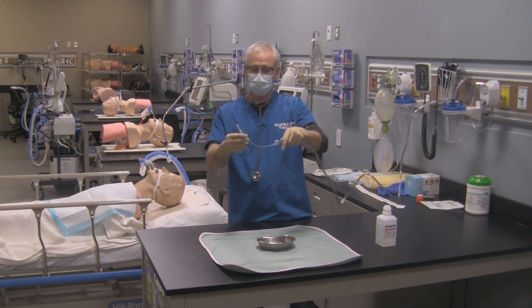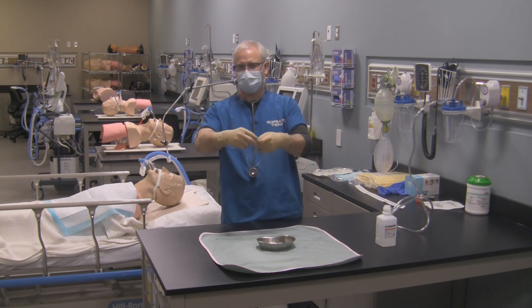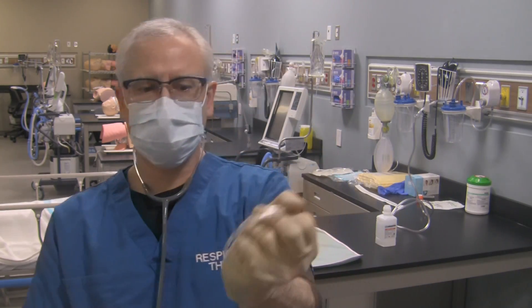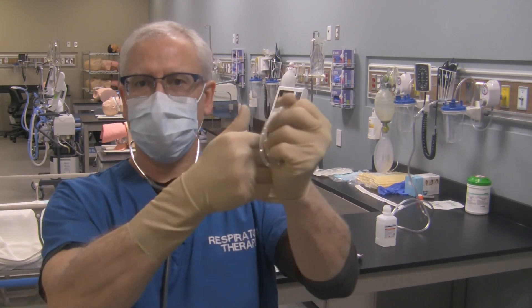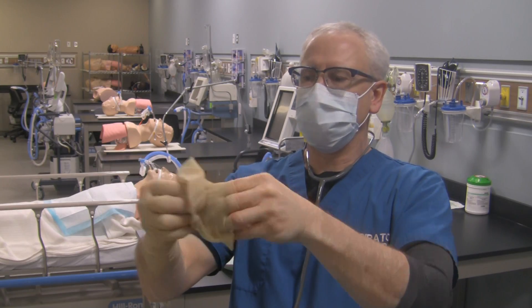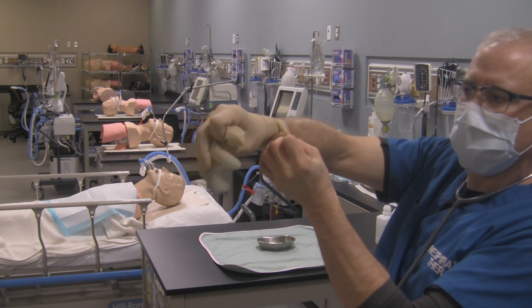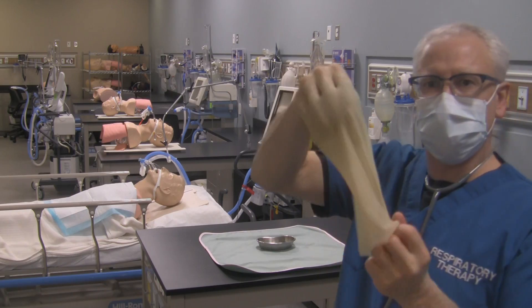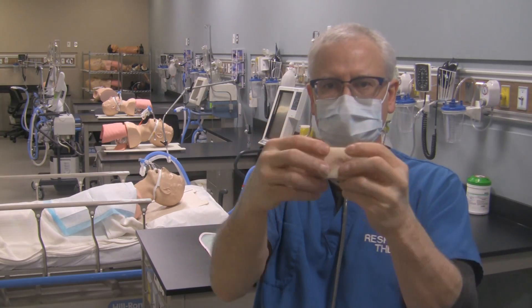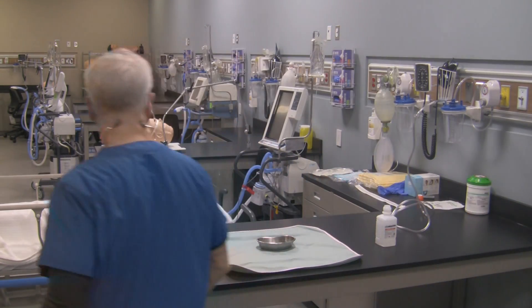So then what do you do with this catheter? Simply disconnect it from your suction tubing. Wrap it around your hand — doesn't matter which hand. Then grab the cuff of your glove and pull it back so the catheter goes into the glove like so. Repeat the process with your other glove, pulling this glove into the other one. All that contaminated material is now safely stuck inside your gloves, and you can touch the outside because that was against your skin anyway. Now dispose of this in the appropriate receptacle.